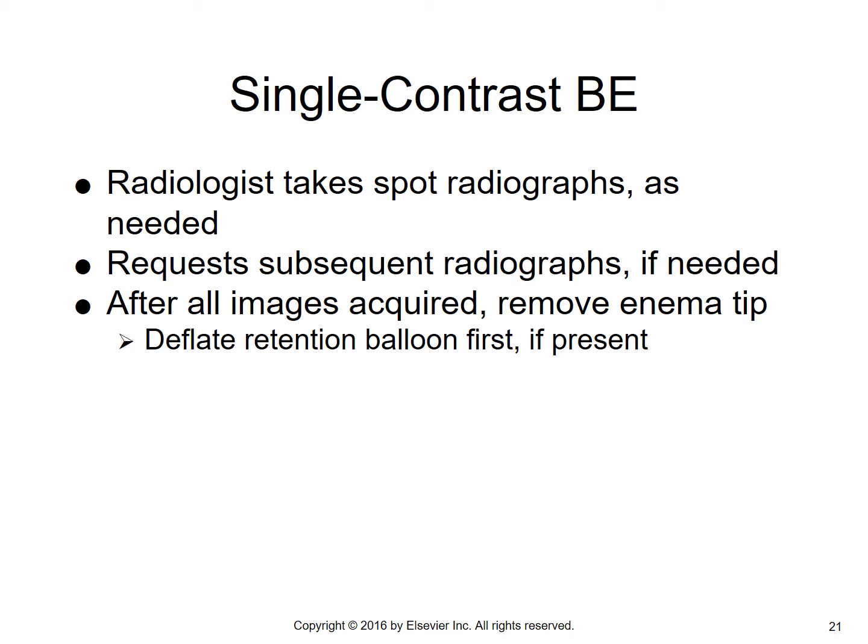Don't forget to deflate the retention tip or balloon first, if it was blown up. You never want to try and pull the enema tip out when the balloon is inflated. So always deflate the enema balloon first.